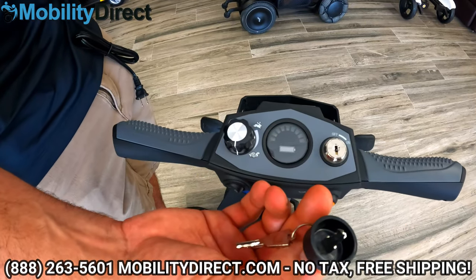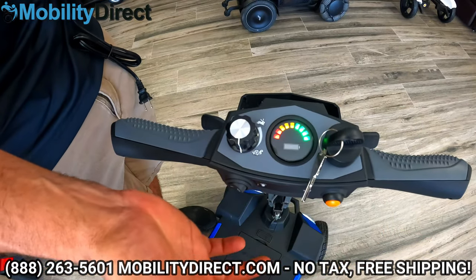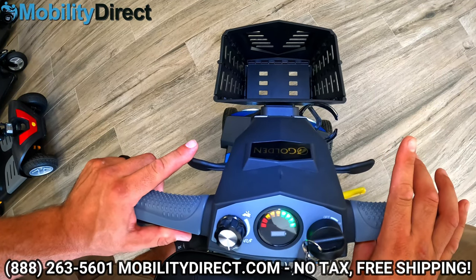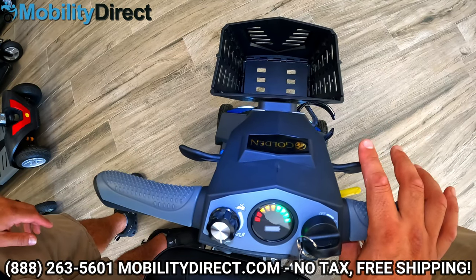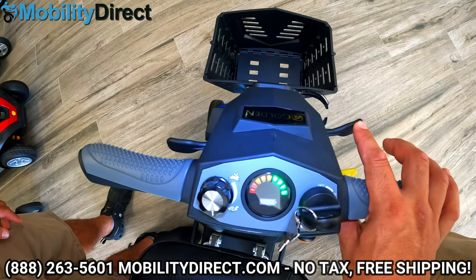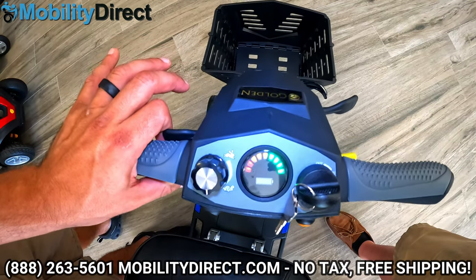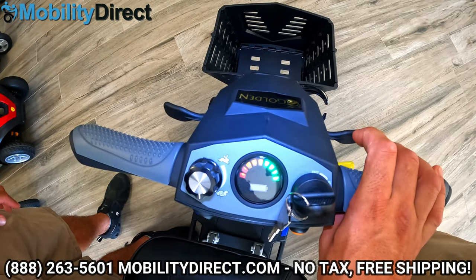Here is the ignition. This is the key — it comes with a spare. Turn it on by going slightly clockwise. As far as the throttle system goes, it has a single-handed use throttle system, which means you can use your right hand or your left hand to control both the forward and reverse feature. With my right hand, if I pull back, the unit goes forward. If I push forward on the paddle on the right side, it goes backwards. If I use my left hand, the controls are just inverted — pushing forward goes forward, pulling back goes back.